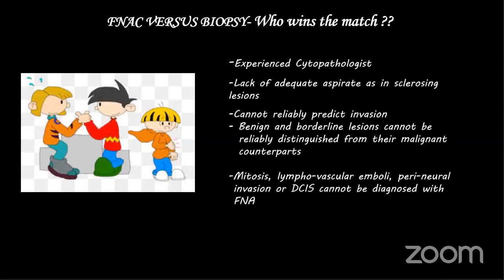So always try to convince your clinical counterpart or the patient for a biopsy, because it actually does not matter to the patient much in terms of procedure. You have to give local anesthesia for both. It is just that slightly thicker needle you are using. Patient will not have pain if you have infiltrated the local anesthesia properly.